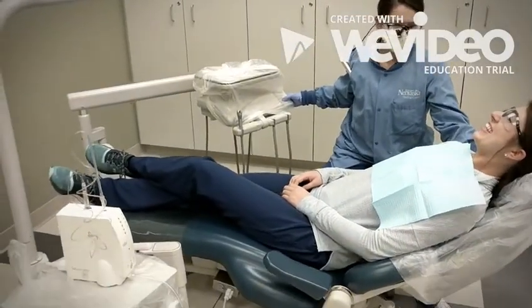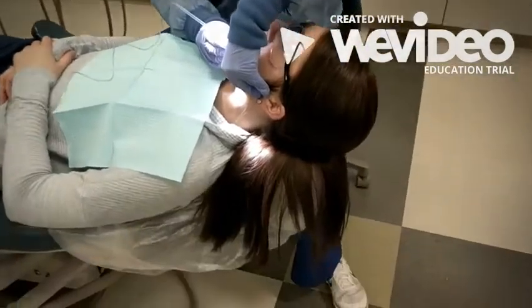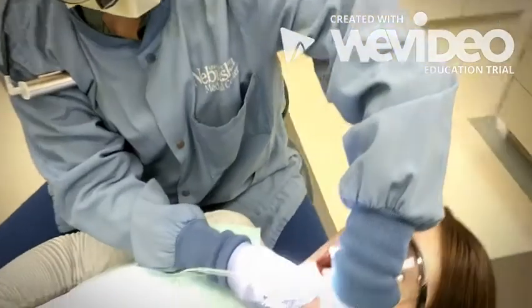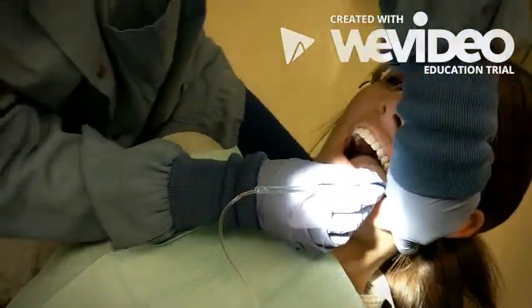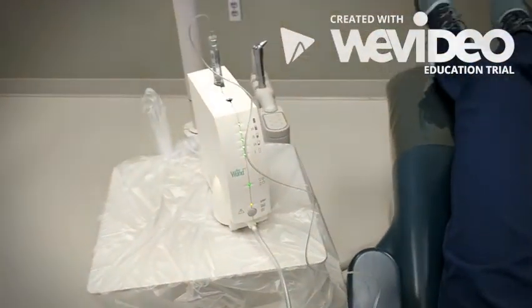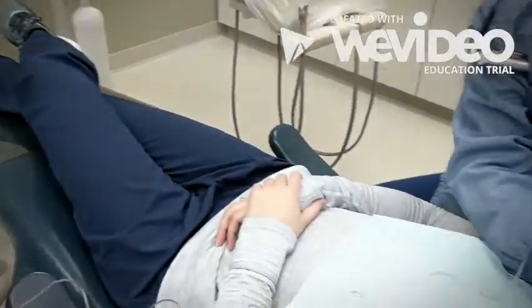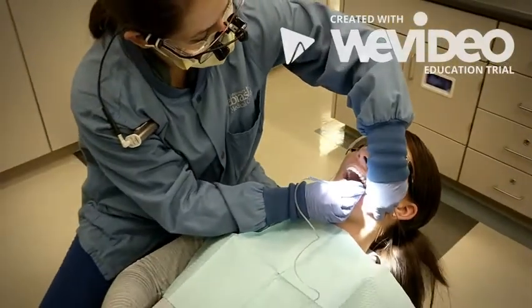Most of the advances in local anesthesia have been in the pharmacology of the drugs administered. The syringe we're used to using is basically the same as the one invented in 1853 by Charles Pravaz. The wand is really the first advancement in the syringe in 165 years, as it offers an alternative delivery system that is computer controlled that makes for a more comfortable and painless injection.